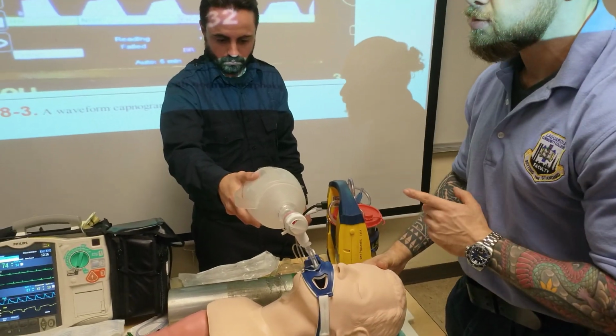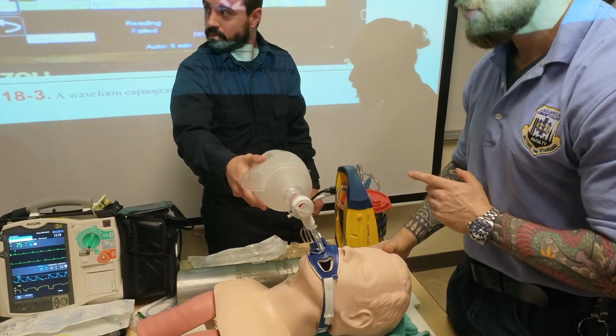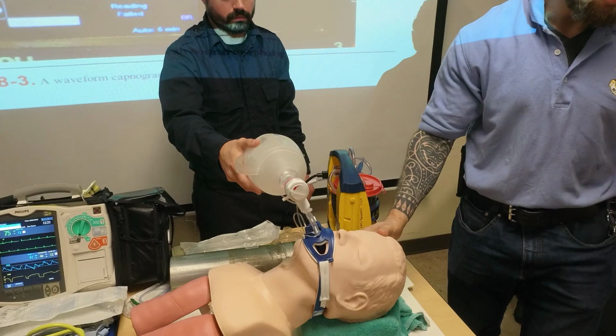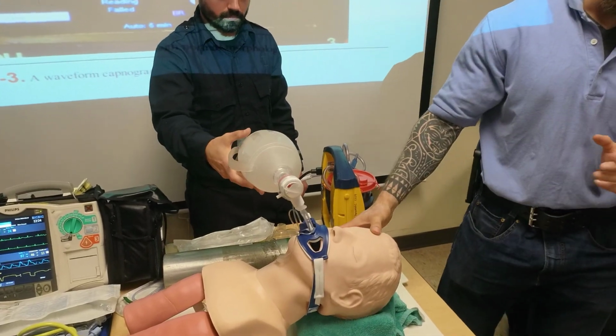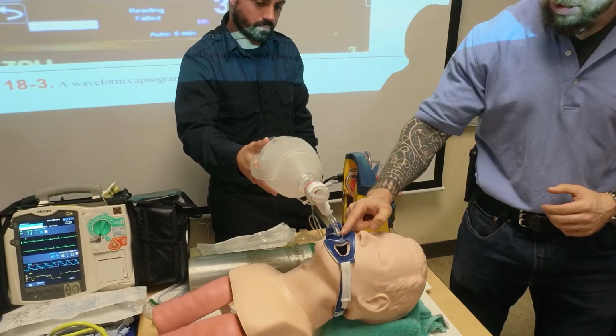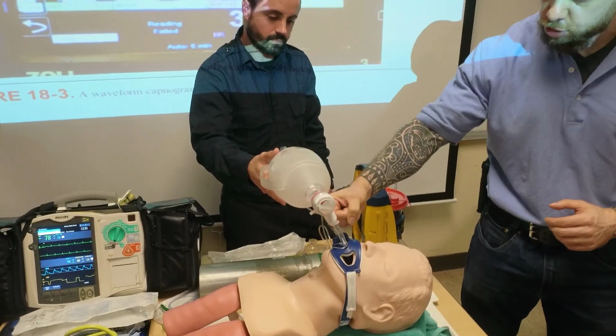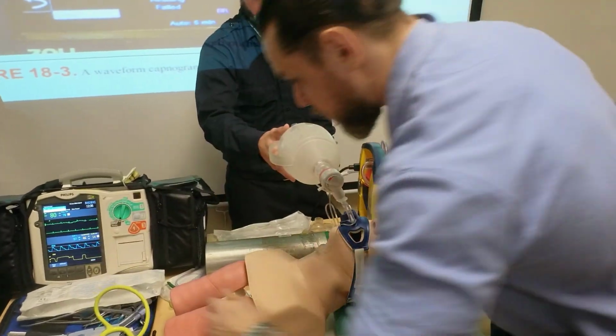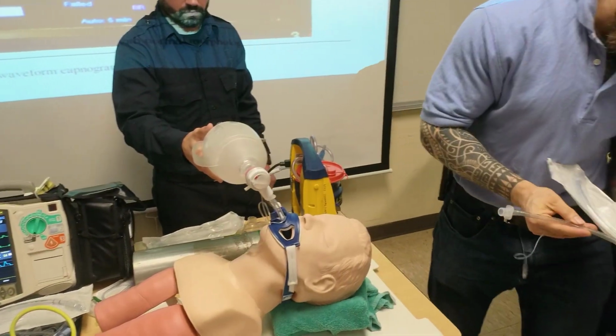So it's going basically right up here when I'm doing it and then pushing down after. Okay. How do we know what size tube? So for an adult man, roughly 7 to 8, right? I want to get the biggest I can so that I have ease of air delivery. I don't want a short tube, right? There's a short diameter tube. It's not gonna give me as much air as this, right? You guys see the difference?